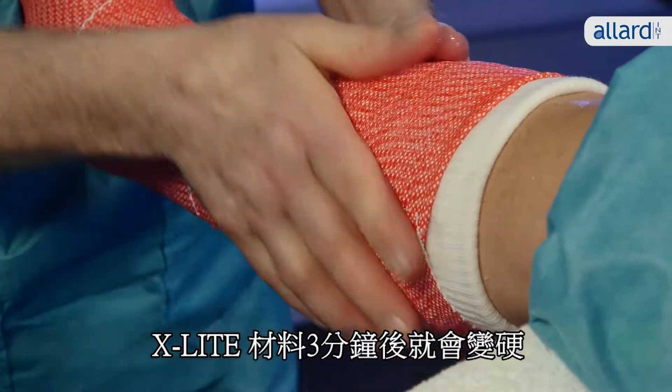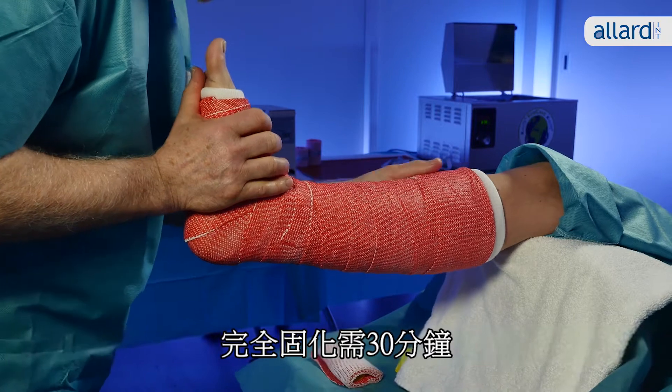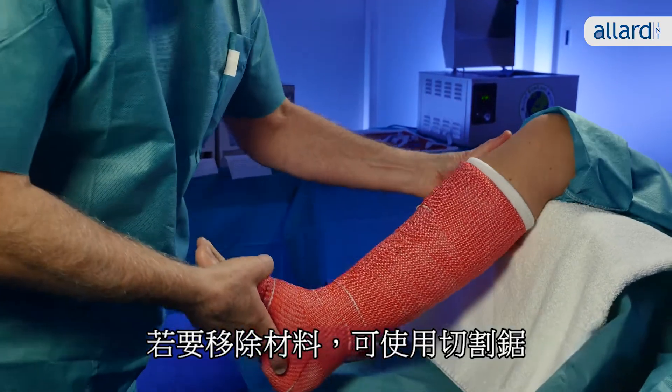The X-Lite material will harden after 3 minutes and be fully cured after just 30 minutes. To remove the cast, use a cast cutter saw.